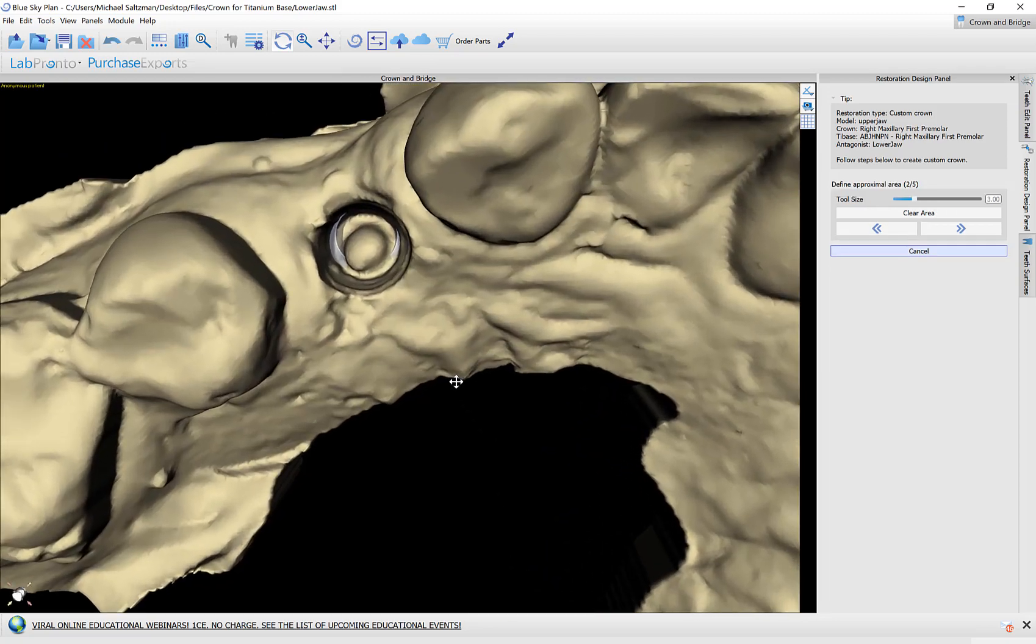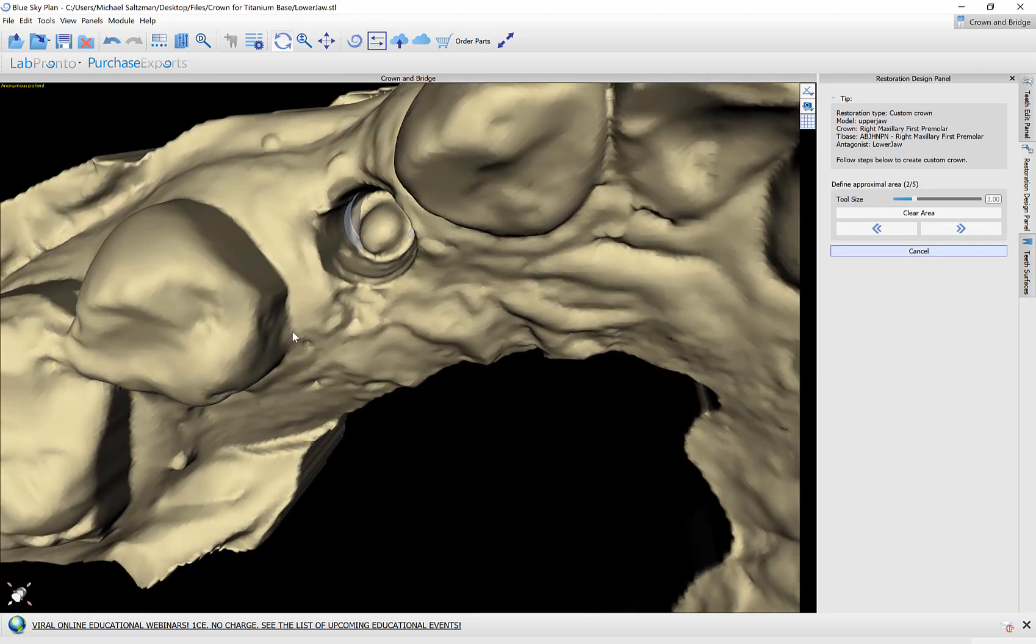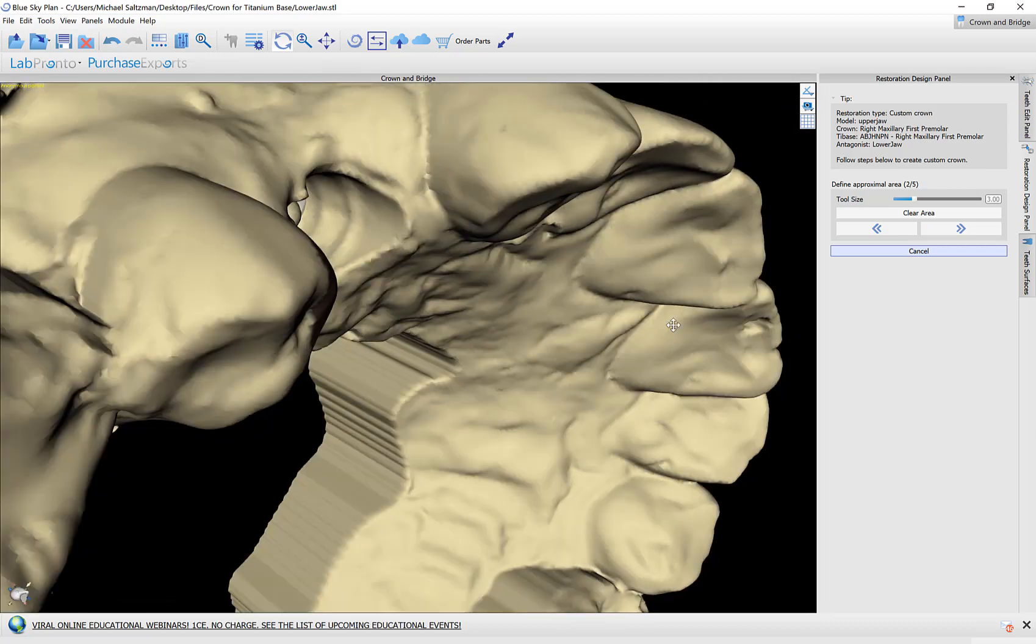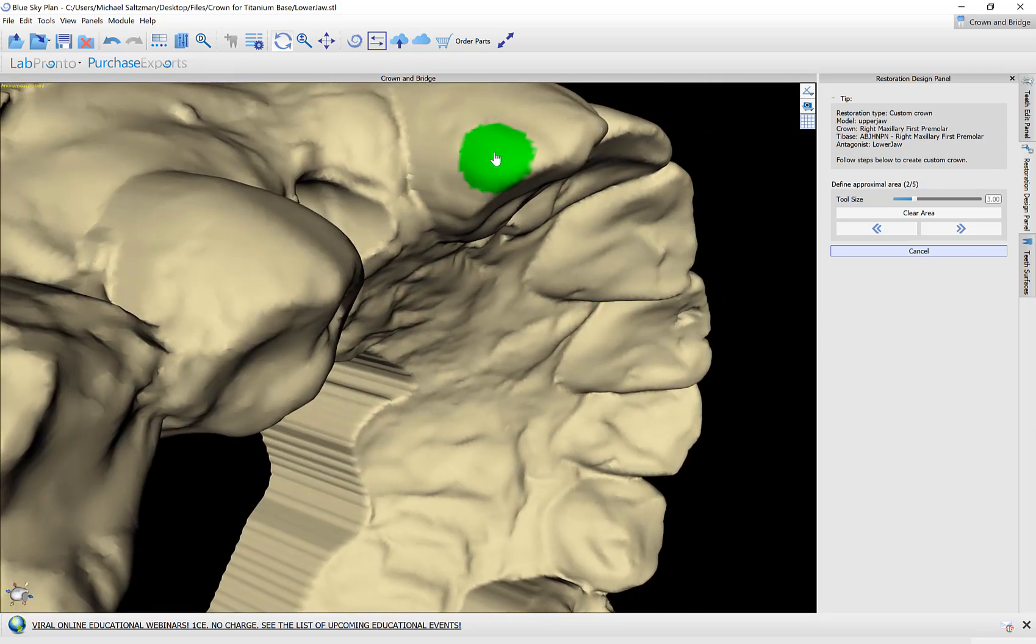The second step is to mark the adjacent teeth holding down the shift key and dragging with my left mouse button.